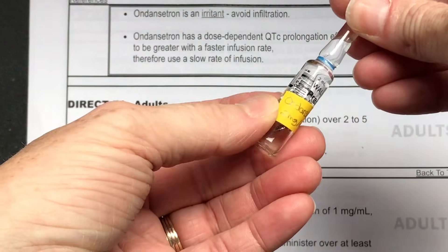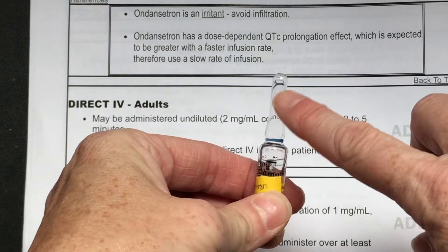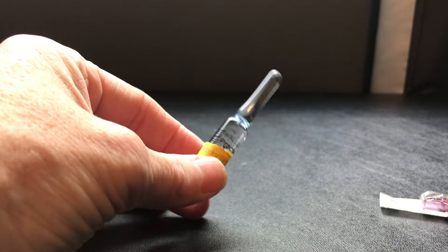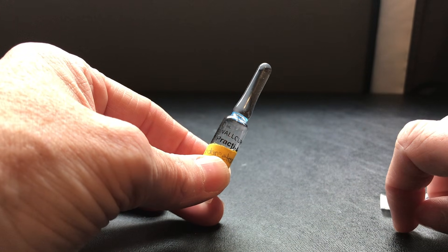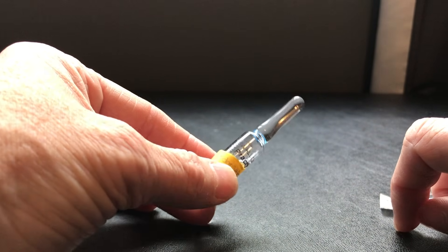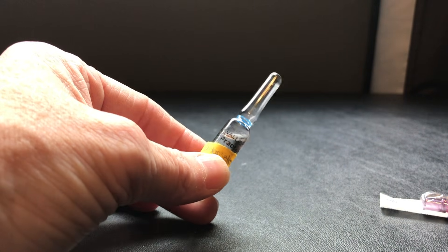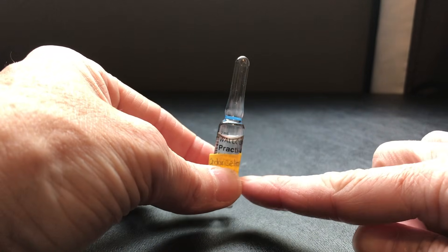I have my ondansetron 2 milligram per mil and found it's in an ampoule. This ampoule has medication up in the tip, so I give it a quick tip — you can see the air has filled the ampoule and the medication is now all at the bottom.